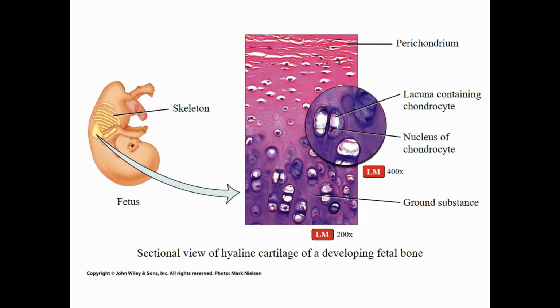Next, we move to cartilage. This is the type of cartilage called hyaline cartilage. One of my favorite, because to me, it looks like it contains googly eyes. For some reason, a lot of times the cells are right next to each other. You see two of them together. And usually the way they pair off, they kind of remind me of googly eyes. So every time I see this kind of cartilage, I know it is hyaline cartilage.